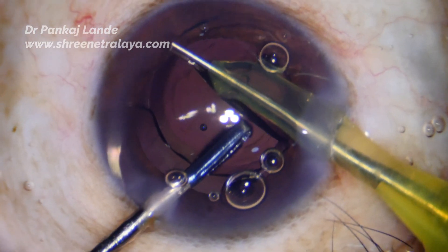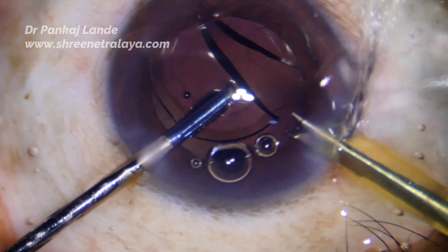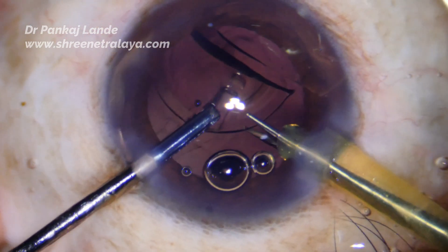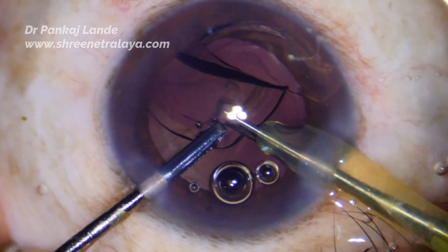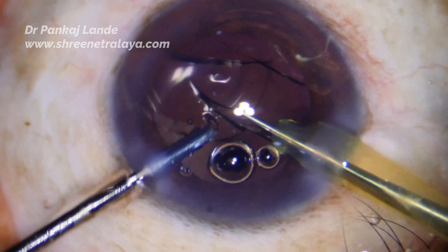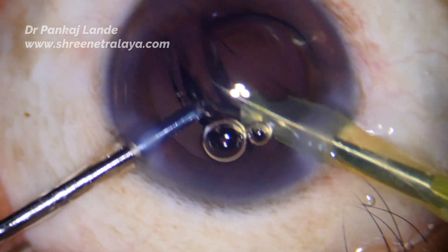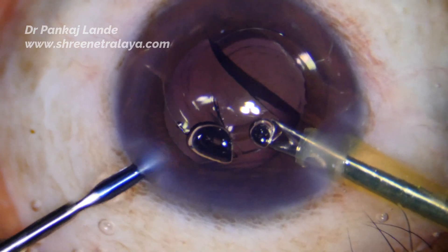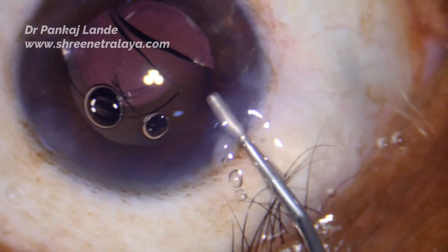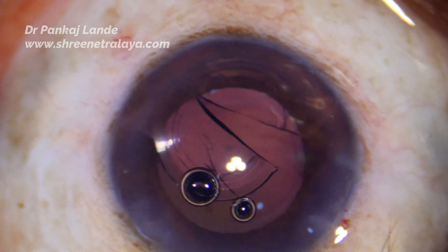The left hand instrument helped me a lot here, and because of the good grip I could do that. For the second cut I have a poor grip in the periphery and I am not able to cut the IOL into further pieces. So I removed both instruments, filled the anterior chamber, made the patient comfortable, and concentrated once more.